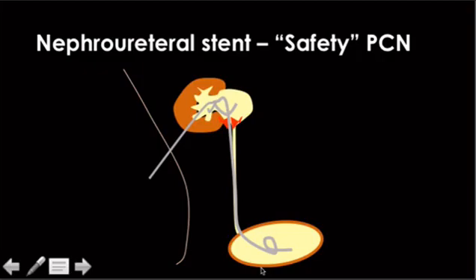So typically, you will leave an extra tube that's like a nephrostomy tube, which is basically what the safety is, in place for like 24 to 48 hours, and you cap it. So you cap it. It's not draining out. You're assuming that it's draining inside. You bring them back in like 24 hours and you look. If their system is like blown up, like they haven't drained any urine for 48 hours out of this kidney, well then you know this thing's not working. And then you have to uncap it and let the urine run back on your shoe.